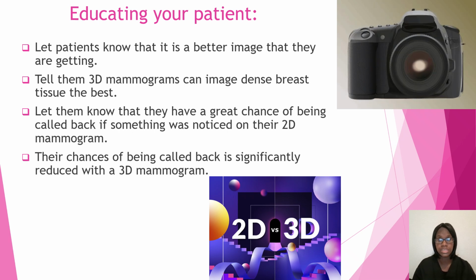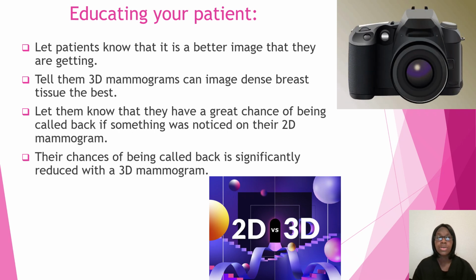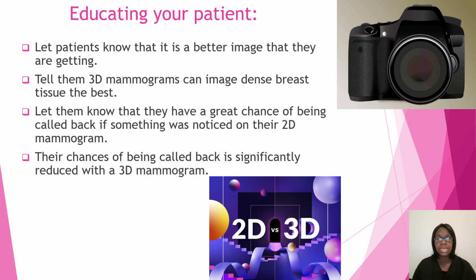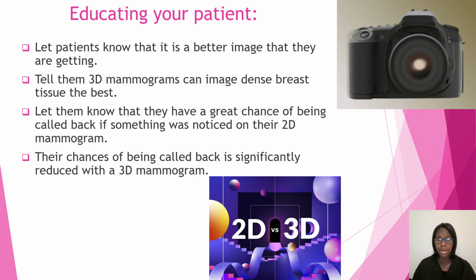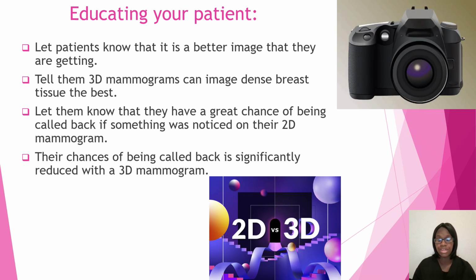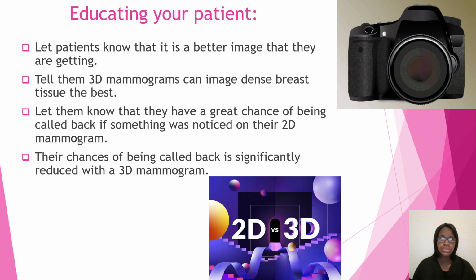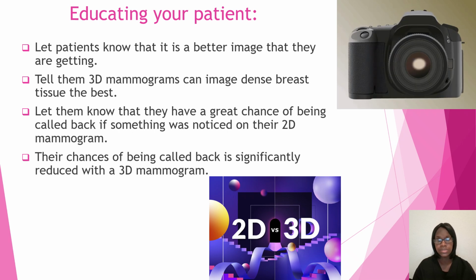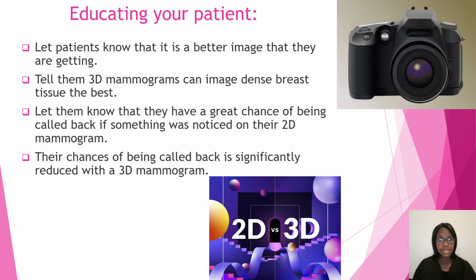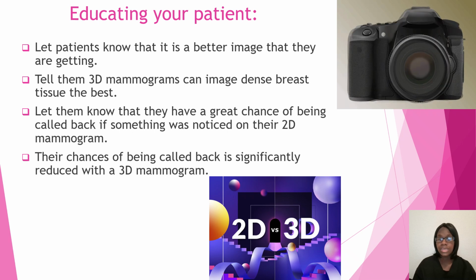Whenever we have situations like this, it's important to educate your patient, because you may get a patient who is probably going to refuse it, or you may get a patient who just accidentally ordered a 2D mammogram online. We have that all the time. Patients can self-schedule a screening mammogram online and choose the wrong kind because they just saw something that said mammogram. You're trying to hurry up and squeeze in your appointment, so they're accidentally choosing 2D mammograms. That's when you educate your patient. You say, hey, did you notice that you ordered a 2D, or your doctor ordered a 2D, but a 3D mammogram is better and preferred to have? Then that's when they'll tell you if they do or if they don't. If they say they don't want it, or they ask you which one is better, that's when you can give them the scenario.